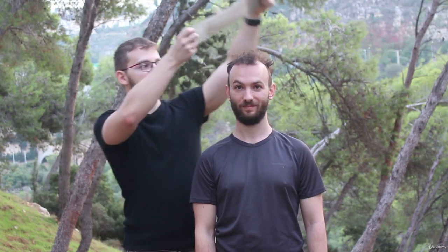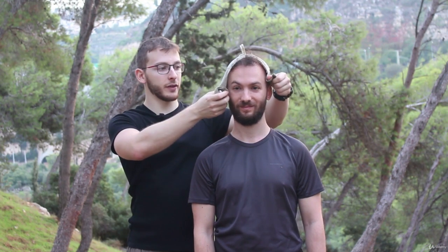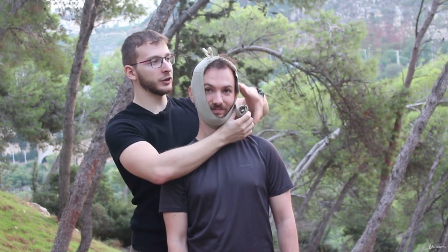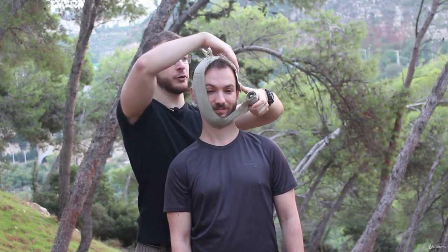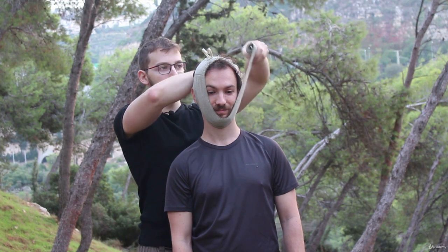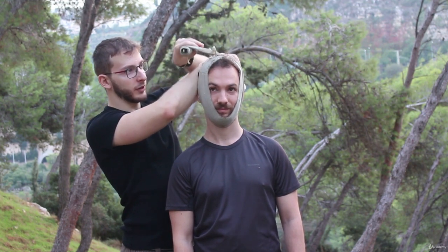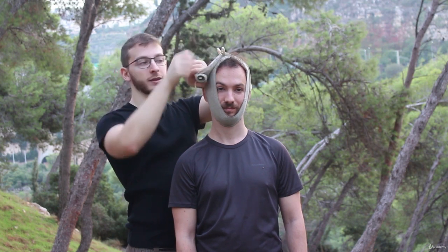Okay guys, now let's learn how to use the Israeli bandage to bandage the head. So what we want to do is open up the bandage, take the sterile side, and put it exactly on top of the injury. And then we want to start bandaging it. In the first loop, I would recommend doing it slowly so it will not fall out of place, and we want to hold it together. And we want to go inside of the plastic thing.